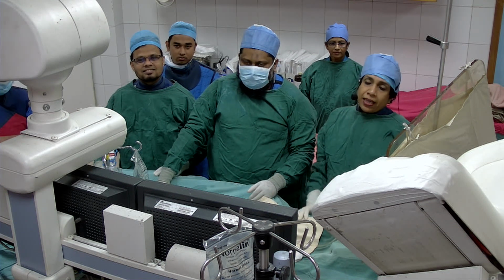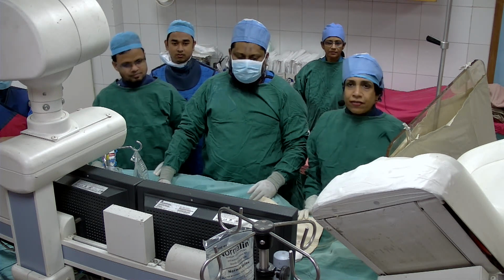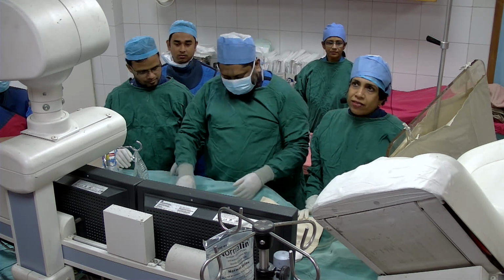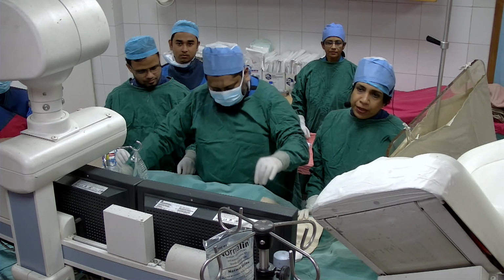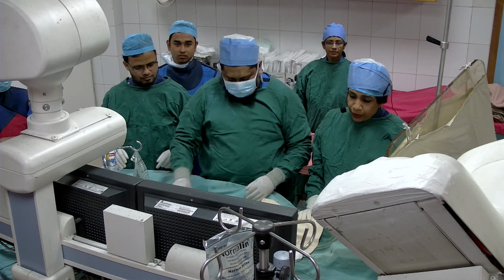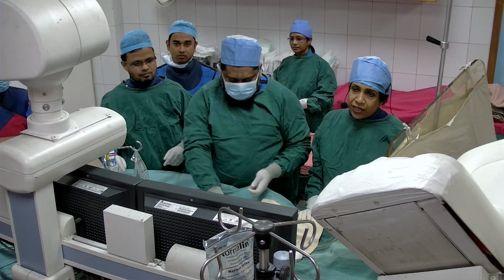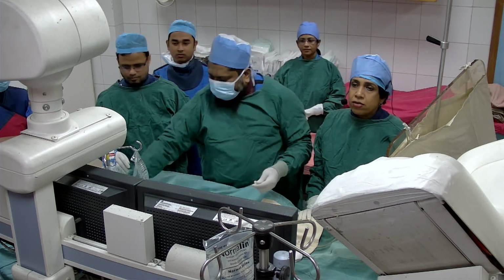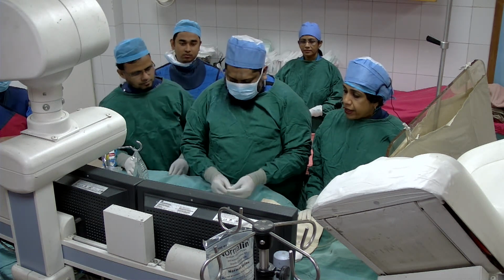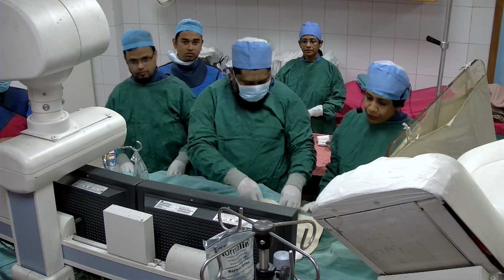So this is an elderly gentleman. He is in his 70s and he suffered from an anterior myocardial infarction a couple of weeks back. His ejection fraction is pretty poor, like 38%. He didn't get any medication because he was far away from Dhaka, and he came to us a couple of days back. We did his angiogram and we found that he had this severe disease and his ejection fraction had also deteriorated substantially. So our plan is today to treat him with the DK crush technique. Now let's go to the angiographic views and we'll explain why we decided to do this.